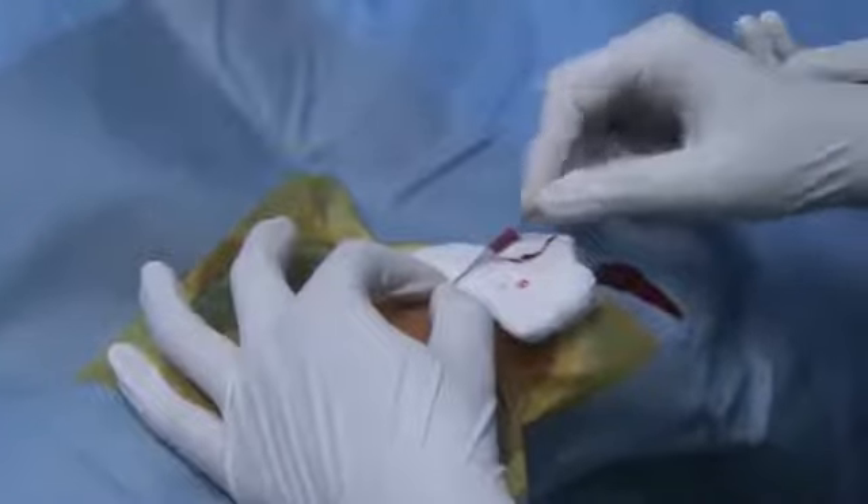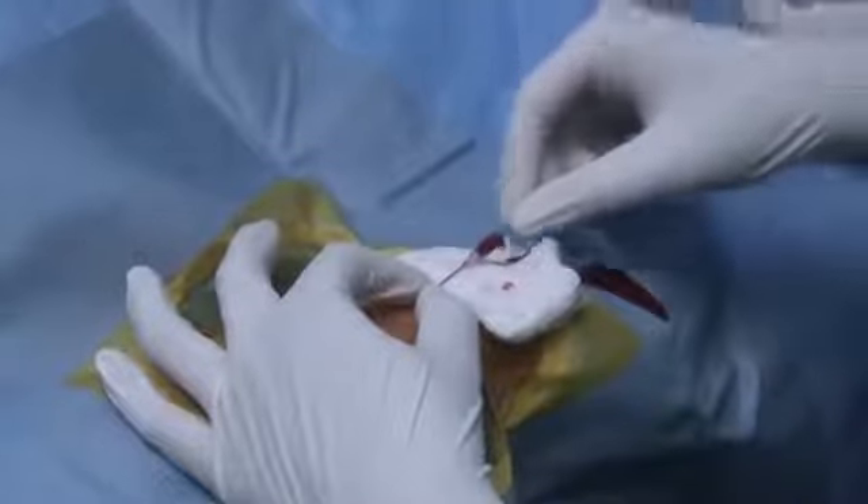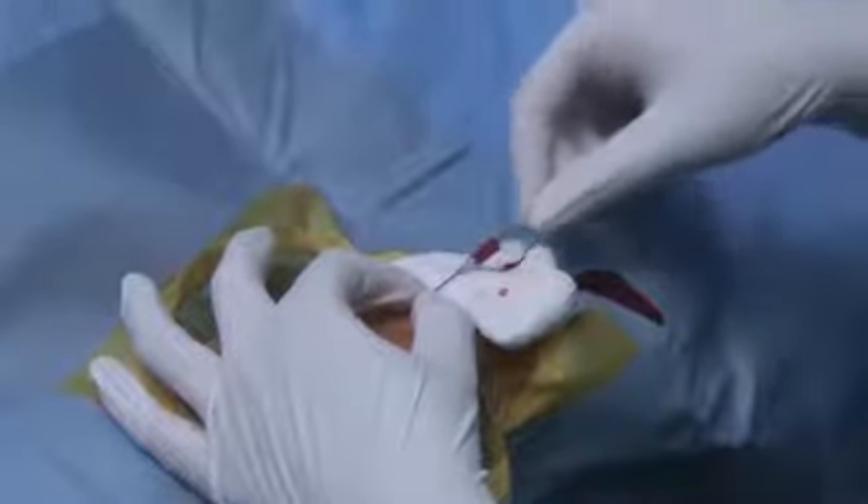The hydrophilic wire available with the Terumo sheath is being introduced through the plastic cannula and pushed up to the brachial artery. The cannula is removed, and now the sheath is being introduced.